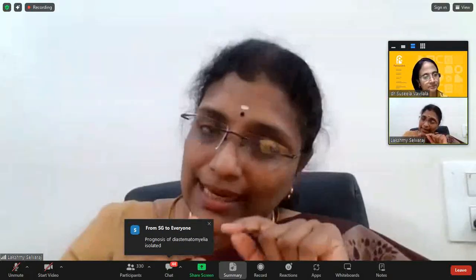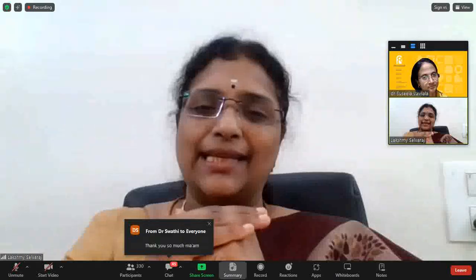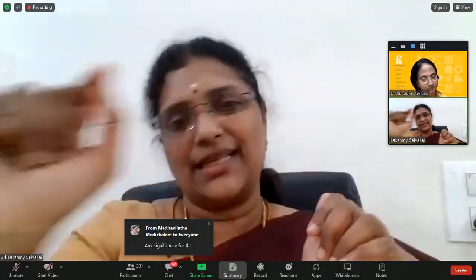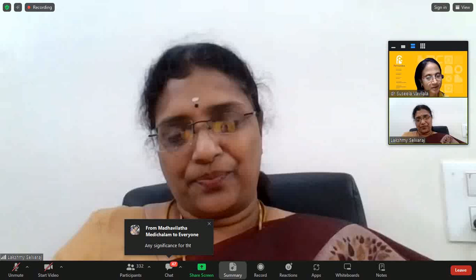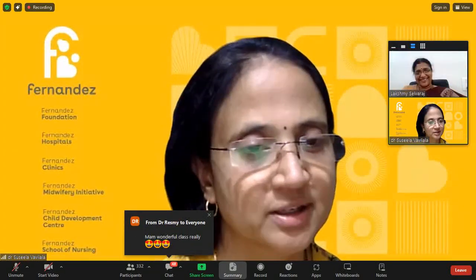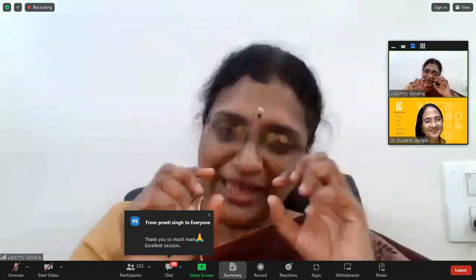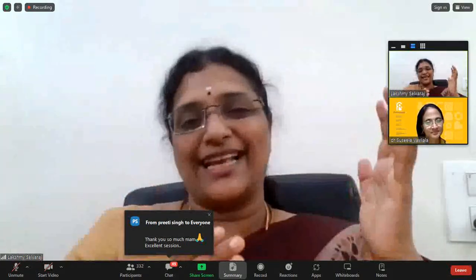And more than the level, I also multiple times reiterated the cord lifting away and touching the skin, and the divergence of the spinal pedicle. All these things will come to your help. It's just not the level. Yeah, that is a very sweet image, very, very cute. The way you showed in the axial section how the cord is actually elevated. It's very cute. Actually, that's a very useful clue. Very useful clue.